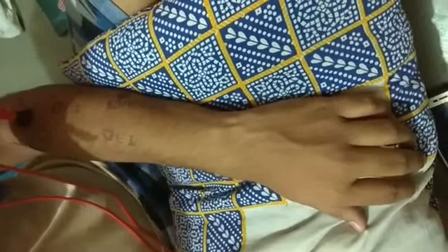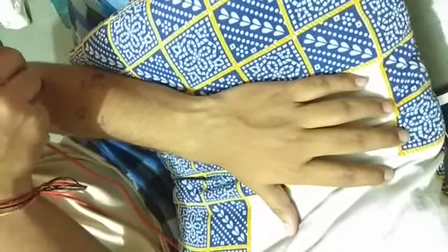This is the motor point for the extensor carpi radialis longus and extensor carpi radialis brevis. The action of extensor carpi radialis longus and brevis is extension and abduction of the wrist joint. This is the motor point for the extensor digitorum. The action of extensor digitorum is extension of the digits.